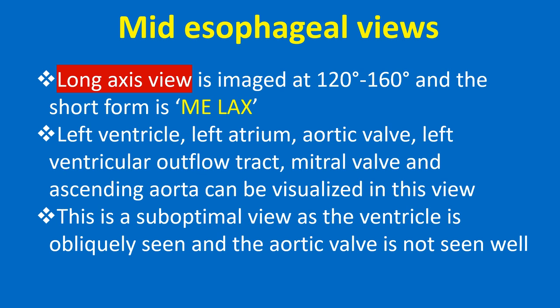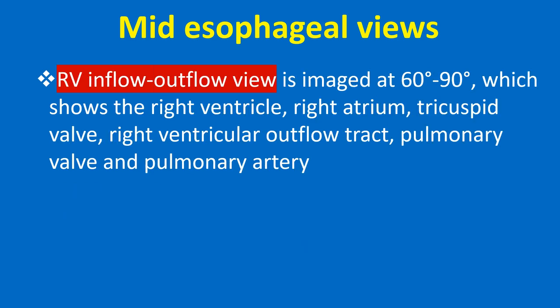In the ME LAX view, the left ventricle, left atrium, aortic valve, left ventricular outflow tract, mitral valve, and ascending aorta can be visualized. This is a suboptimal view as the ventricle is obliquely seen and the aortic valve is not seen well.